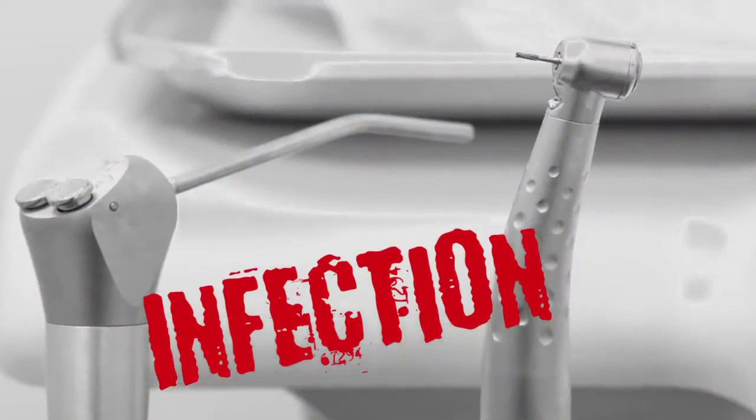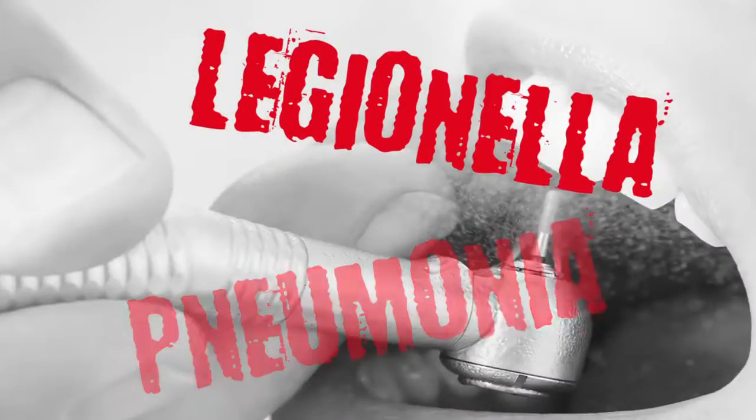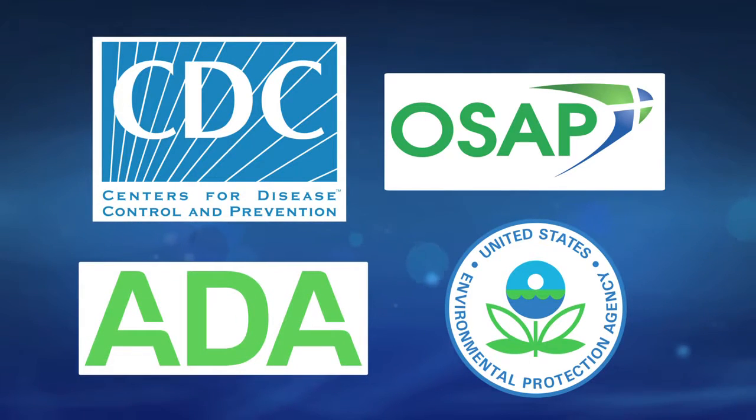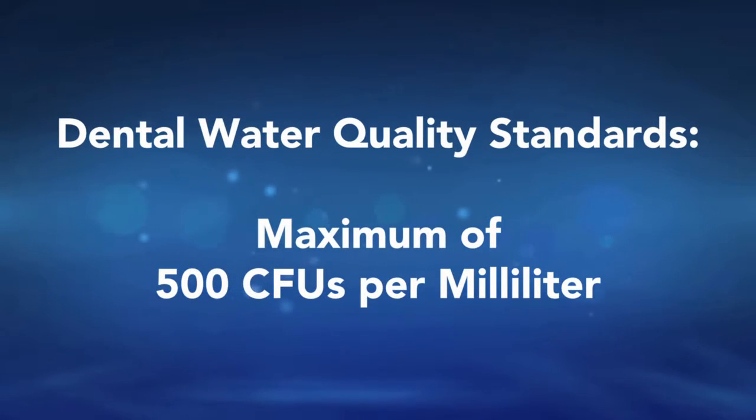These bacteria damage your expensive equipment and are hazardous to your staff and potentially dangerous for patients. No wonder the CDC, OSAP, EPA, and ADA have set standards for dental unit water quality, allowing a maximum of 500 colony-forming units per milliliter.